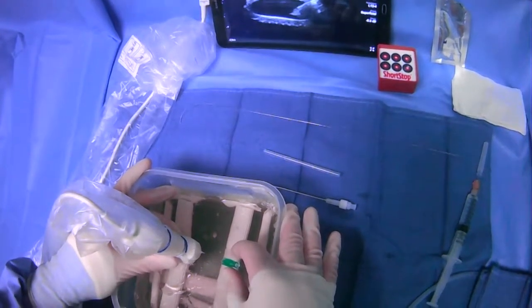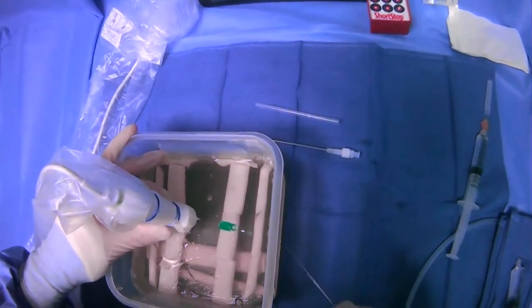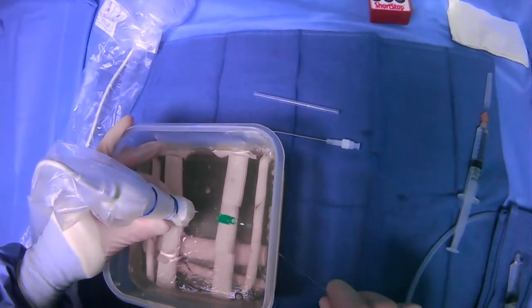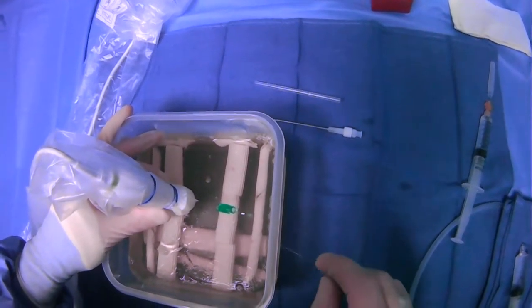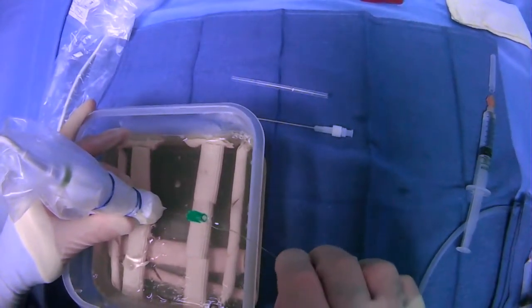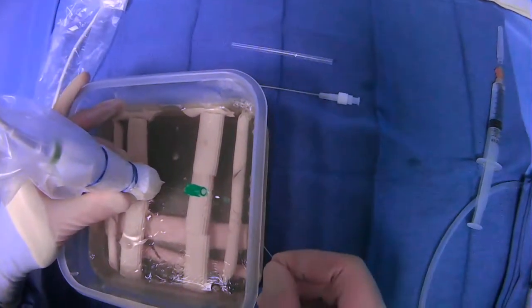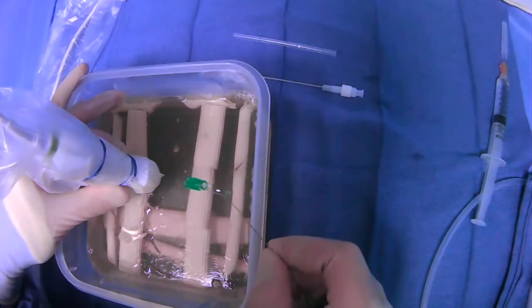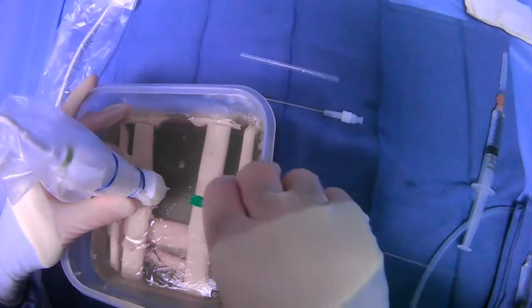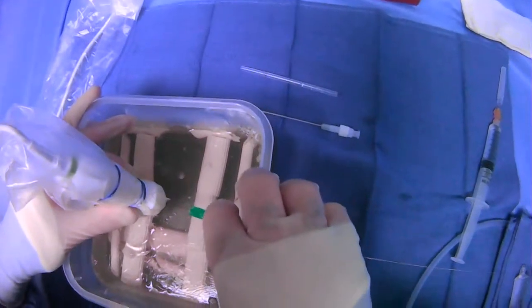You can let go of the needle or let go of the probe, but regardless of how you do it, you're going to have to keep the other hand in place. Here, I've let go of the needle, so I'm just going to grab my microwire and put it in through the needle hub. There we go — you can kind of spin it as you go and just push the wire in.